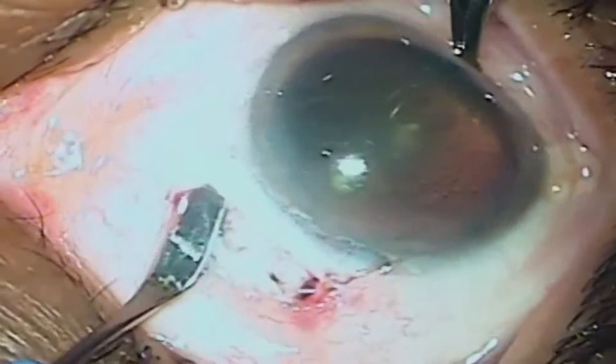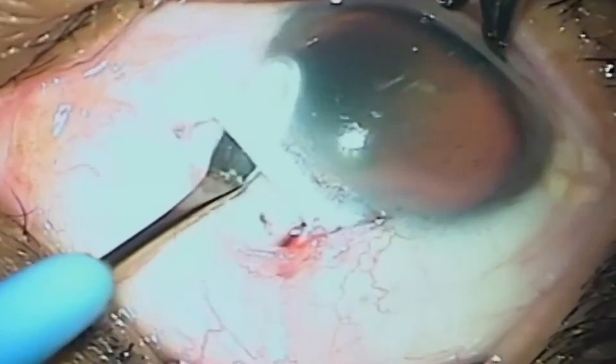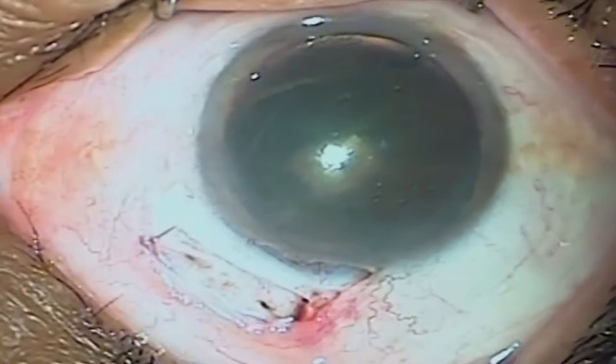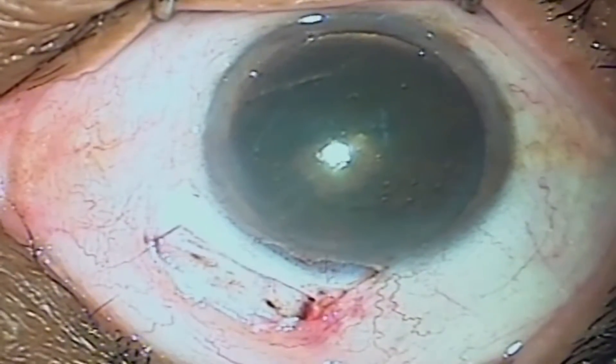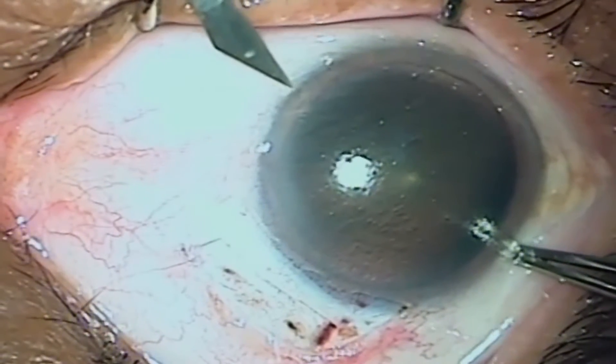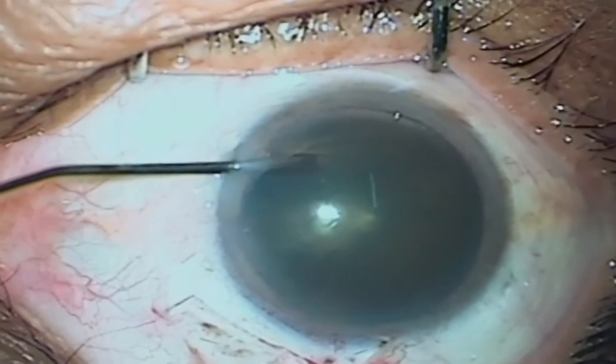Place the incision on the steep axis, sizing it according to the pre-existing astigmatism. Always discuss the needs of the patient. In this case we are operating the right eye and targeting emmetropia.